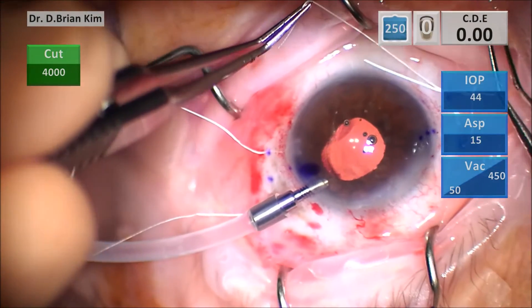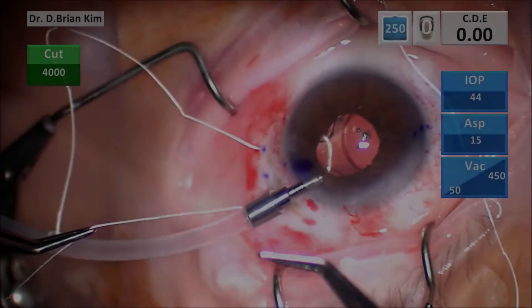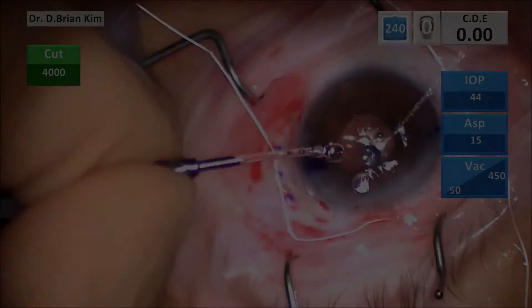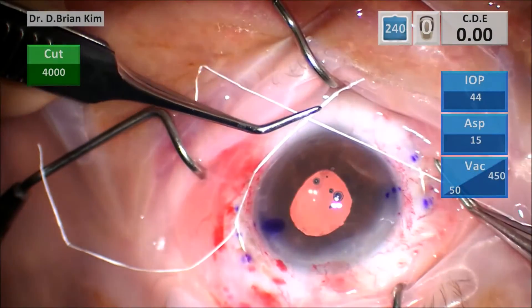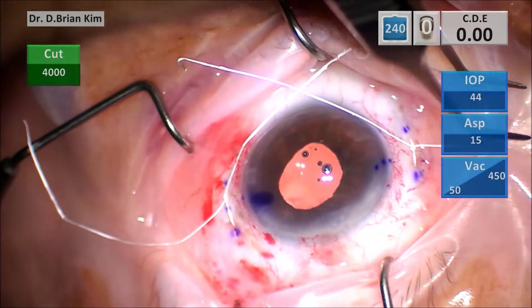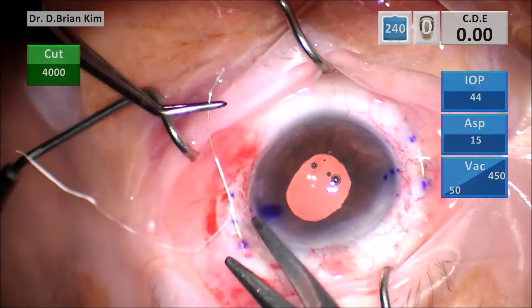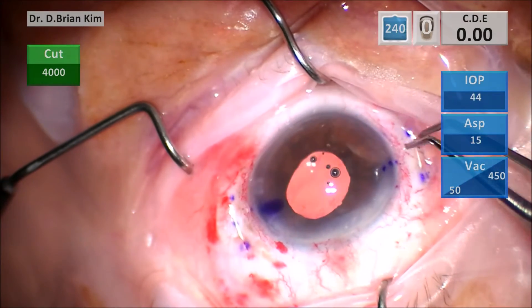I made two throws on the initial knot on this side but kept it fairly slack. On the other side I actually loosened it after this step because it was a little bit too tight. I did a slip knot on the left side after the fact. Once I got the right tension, I tied them down and cut. I want to make sure I use a slip knot technique next time so I don't have to be fighting the tension. The Gore-Tex suture is a little bit unforgiving — once you pull on it and have two or more throws, it won't budge. So the slip knot technique is definitely helpful.